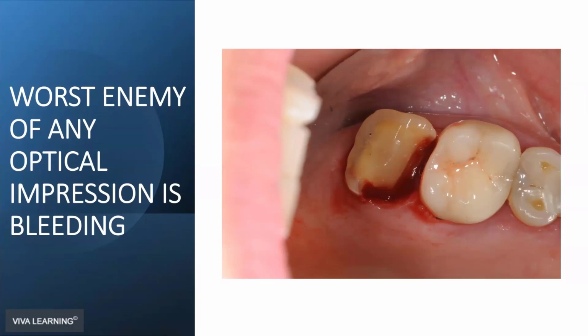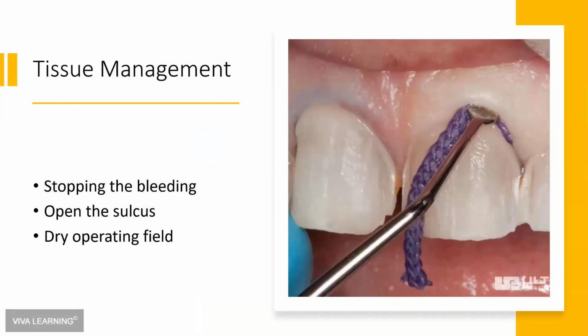By the pressure that you're applying with the impression material, you actually can additionally push the gingiva and obtain even more detail. With intraoral scanning, what you see is actually what you get. So in the first place, you want to have a clean and dry operating field.